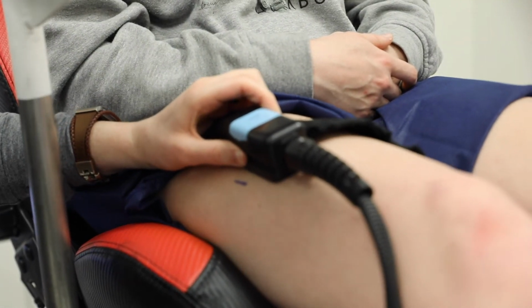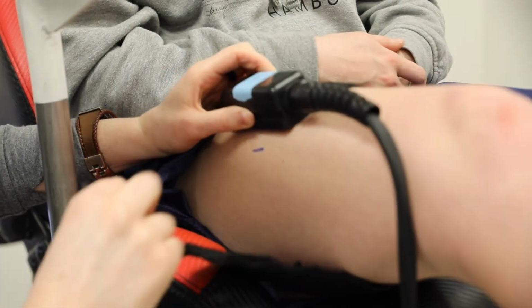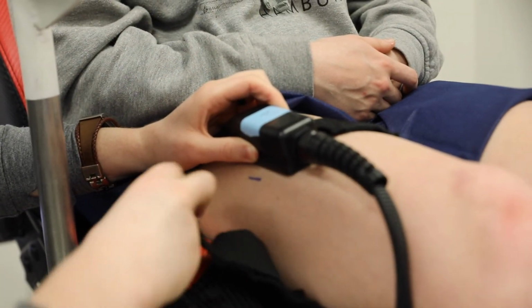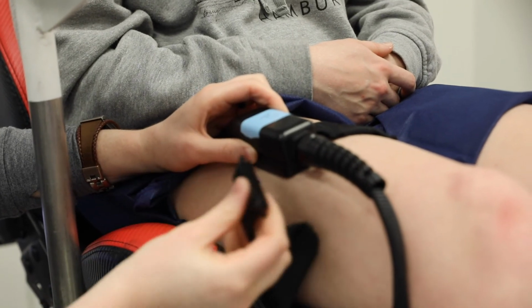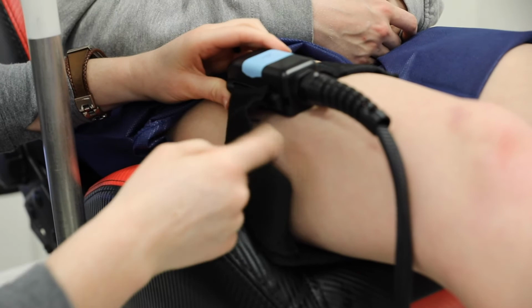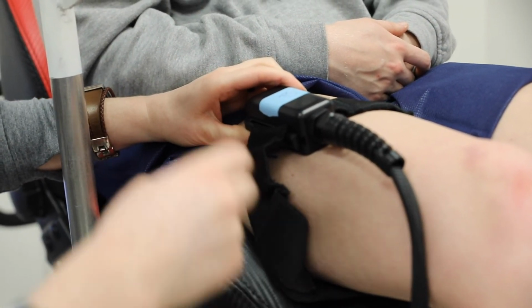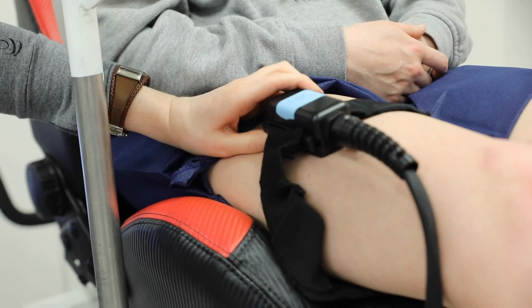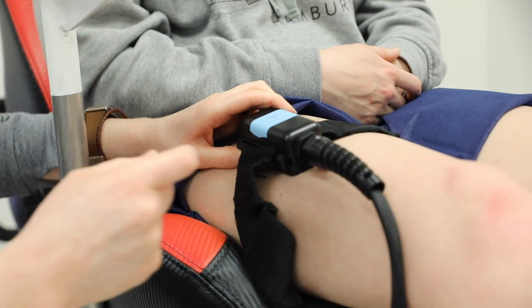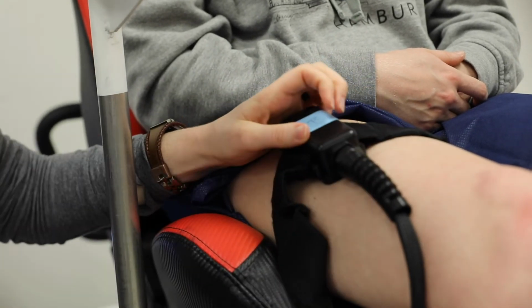So once it's there, you're going to wrap this strap around. You want to lift your leg for me. And this part just slides right in. You can unvelcro the strap and tighten the strap as well. Then we usually use the conform tape to also wrap around it and cover the entire probe.